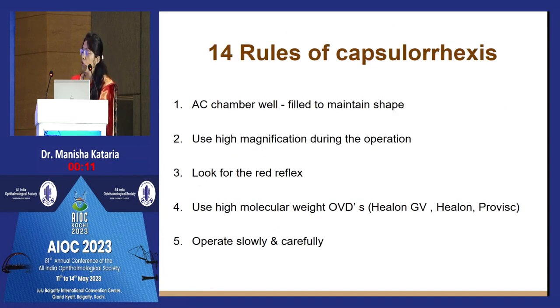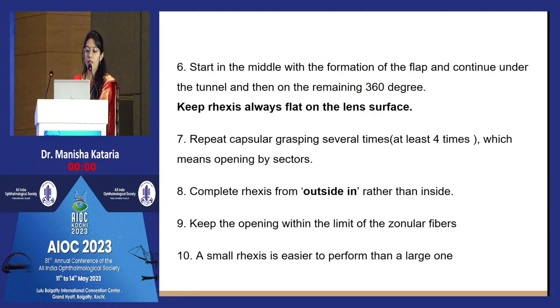So, the take-home message is that the AC should be well filled to maintain shape. Use high magnification during the operation. Look for the red reflex. Use high molecular weight OVDs. Operate slowly and carefully. Start at the middle with the formation of the flap and continue under the tunnel, then on the remaining 360 degrees.